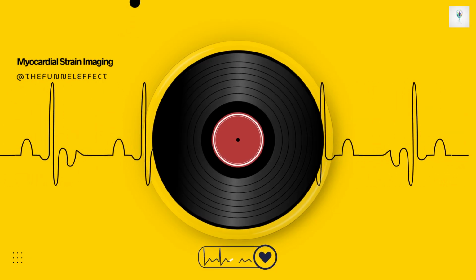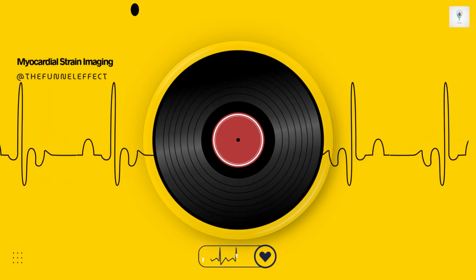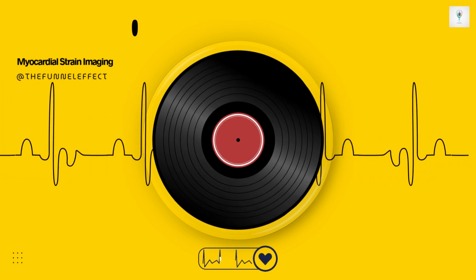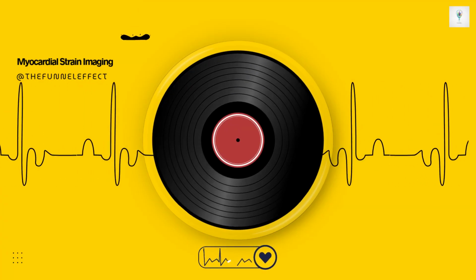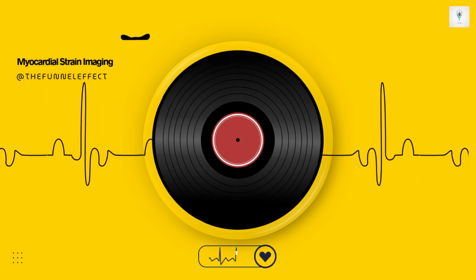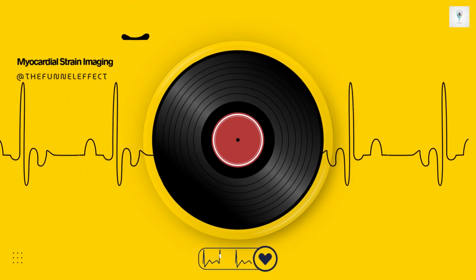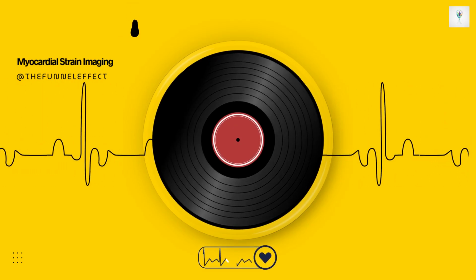That's the cornerstone, absolutely. GLS, which today we typically measure using speckle tracking echocardiography, or STE, well, that's the single most widely adopted clinical metric. Why is that? Because it captures subtle dysfunction much, much earlier than pretty much any other non-invasive parameter we have. Understanding GLS is, frankly, a prerequisite for modern cardiac risk assessment.